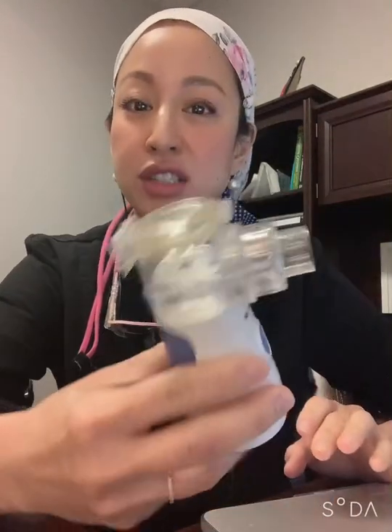Anything that's oily or syrupy, don't nebulize with that. You just want to nebulize with something very thin, like your saline mixed with your hydrogen peroxide. One of the answered questions on Amazon was, "Can I nebulize with albuterol in the mesh nebulizer?" And the answer was yes.